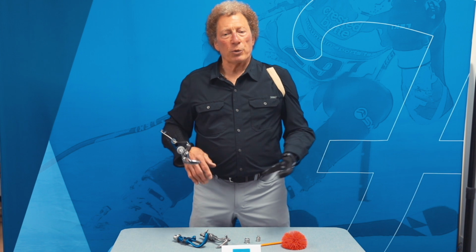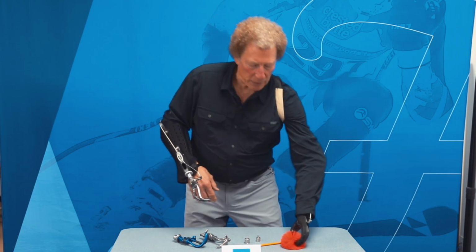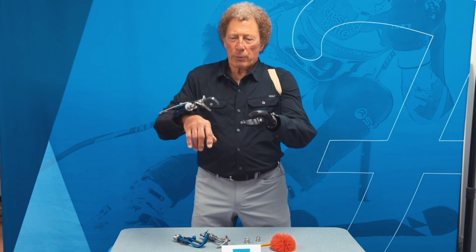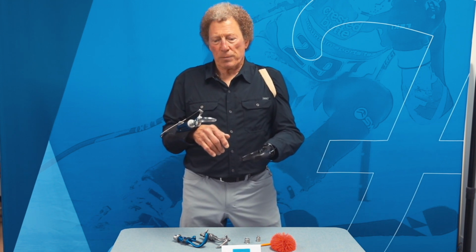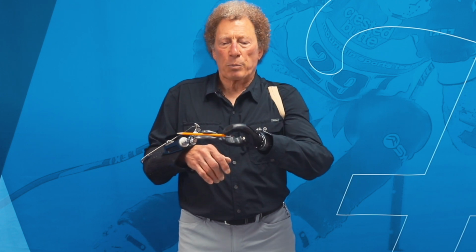The other thing is that the split hook works in what I would say is inversely proportional biofeedback. When I grasp on and pick something up, if I hold on to this, it holds on by itself. It's like having a passive vise on the end of your arm, which can be convenient, but I can't feel what's going on with that grasping force anymore. Why is that a limit? Well, if I were to pick up a delicate object, I would have to hold back and restrain myself to prevent that object from being crushed. When I'm holding something, I completely lose the feedback loop. I have no idea how much pressure I'm applying to it. So it's kind of an inversely proportional relationship.